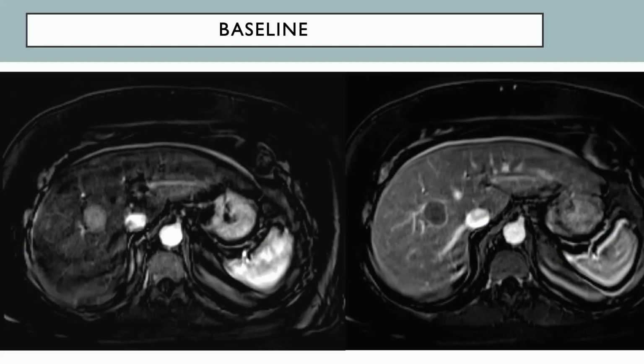And as an institutional kind of approach, and this was more of a case at Emory than UNC, we tend not to stick the liver percutaneously if they're a transplant candidate. I think that's a reasonable consideration. Yeah. We didn't follow that. We treat with the way the BCLC algorithm worked. And so we actually would probably consider ablation here.